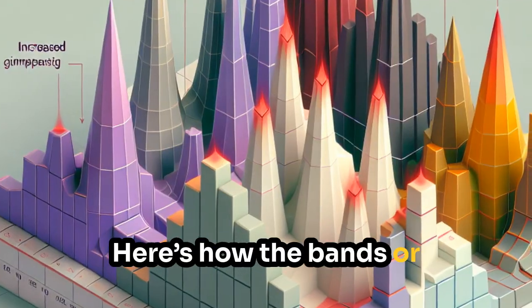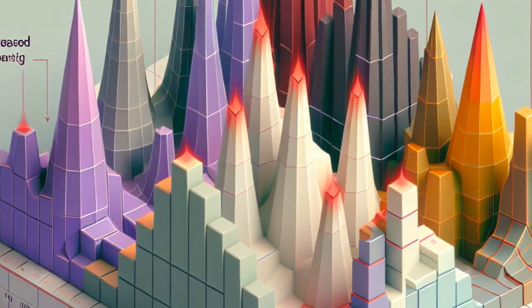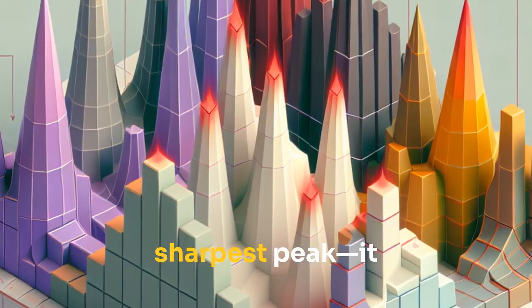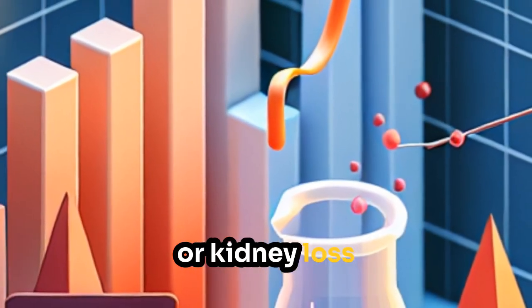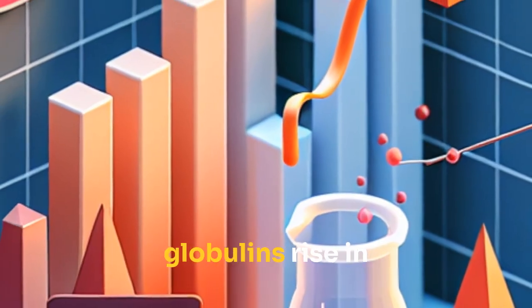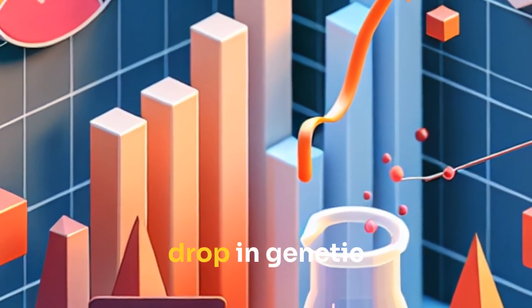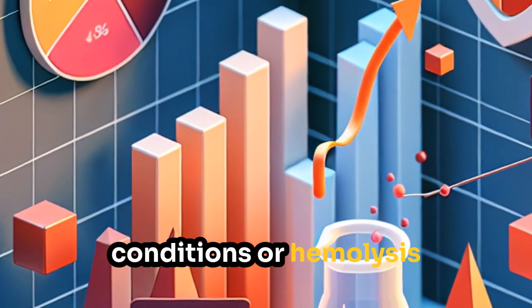Here's how the bands or peaks are interpreted. Albumin is the tallest, sharpest peak. It drops in liver disease, inflammation, or kidney loss. Alpha-1 and alpha-2 globulins rise in inflammation but drop in genetic conditions or hemolysis.